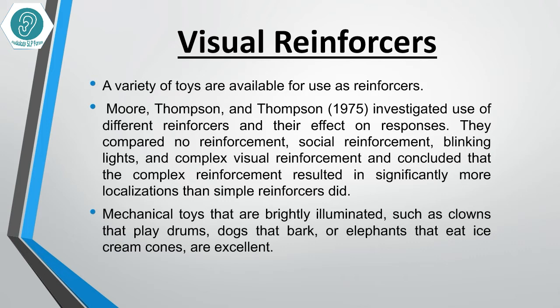They concluded that complex reinforcement resulted in significantly more localization than simple reinforcers did. Mechanical toys that are brightly illuminated — such as a clown that plays drums, a dog that barks, or an elephant that eats — are excellent reinforcers.